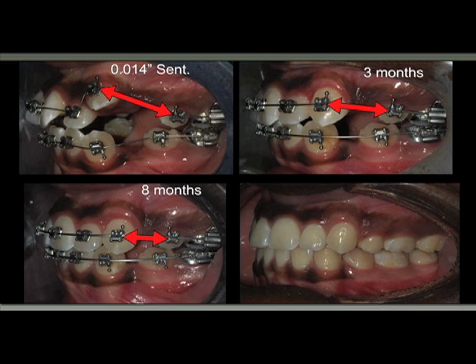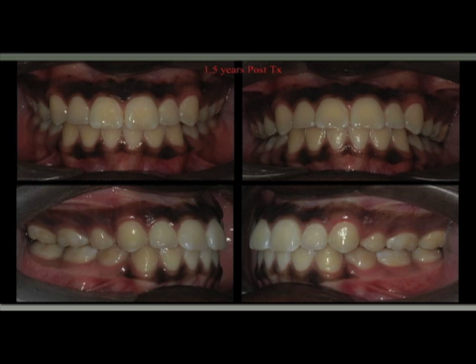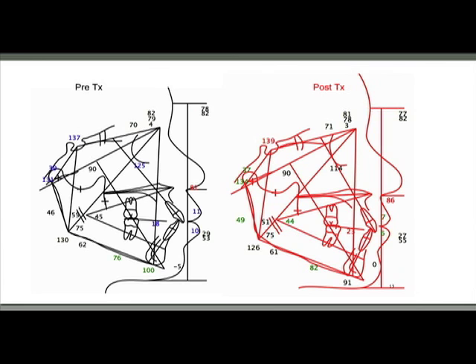And that's the beauty of this system, that as you level and align, the wire goes back. It's easier for the wire to go back than to move teeth up or forward. And therefore, you have this basically dental anchorage built into the appliance. Now you have the finished case here. That's after 1.5 years post-treatment. And then that's the x-ray before and after.